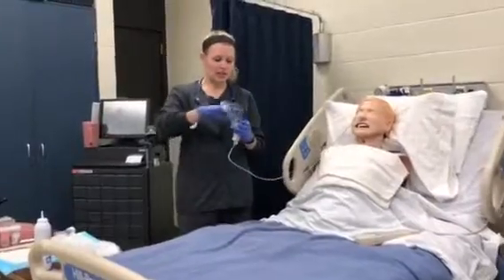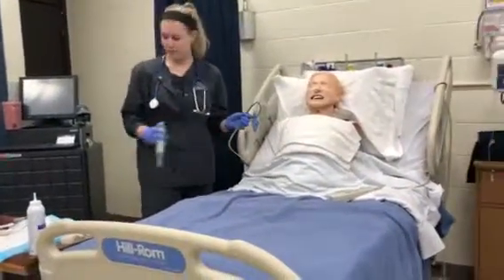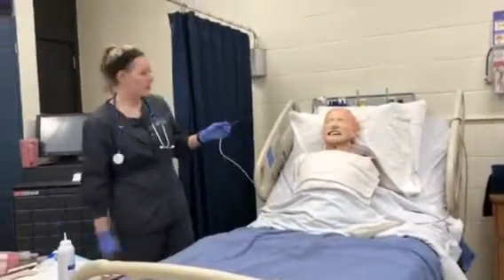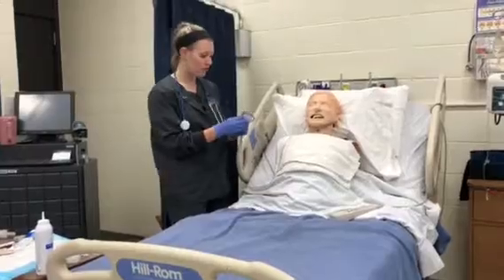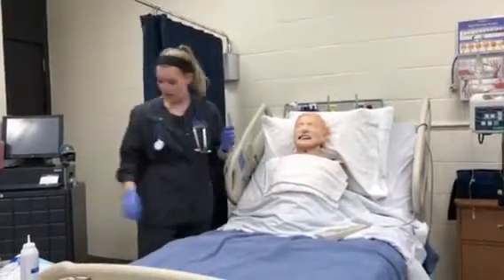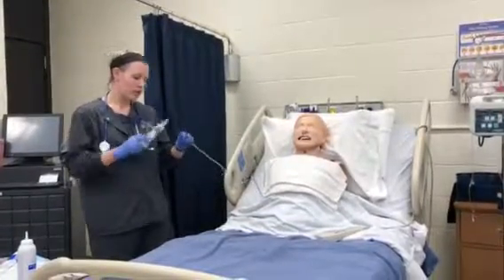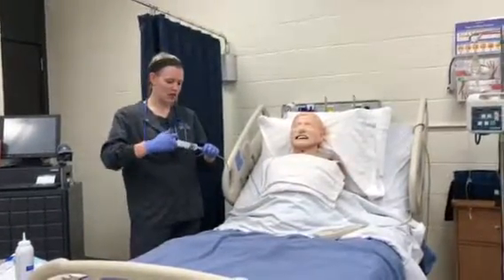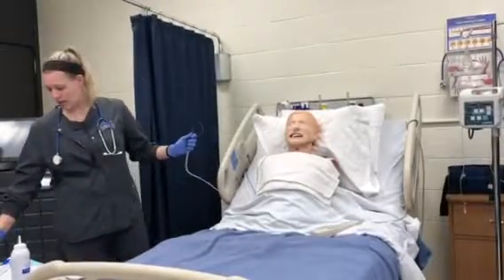Okay, so now we've given meds and our patient's better and ready to go home, so we've got to get this NG tube out. We explain the procedure. We just tell them basically it's just a deep breath and we pull it out for them. Before we take it out, we always flush with air or water, either one. So I'm just going to flush with air, just to make sure everything in that tube is in their stomach, so when I pull it out, it's not going to go everywhere.